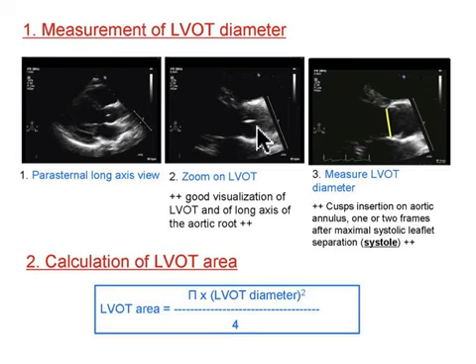Now, this is just a frozen and zoomed in version of that exact same valve. The leaflets are together. So in that frozen state, you can then take the dial, bottom left-hand button, and rotate that dial counterclockwise, and you'll back up to where end systole was. And those valve leaflets, you'll watch them just kind of march right open. And once they're open at their maximal point, you can take a measurement using the calculations functions between those two leaflets, and that's your LVOT diameter, your left ventricular outflow tract diameter.